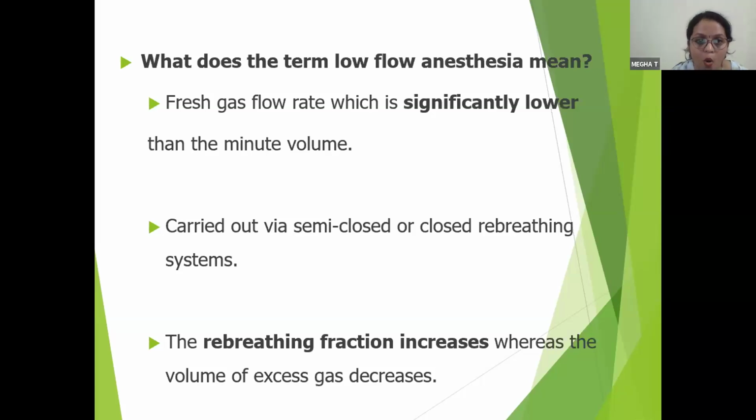So what does low flow anesthesia mean? As the term says, it's low flow, but how low should the flow be? The fresh gas flow which is significantly lower than the minute volume, this is nothing but low flow anesthesia. I'll talk about it in detail. Usually, when such low flows are used, the anesthetic gases must be conducted to the patient via a semi-closed or even a closed rebreathing system.